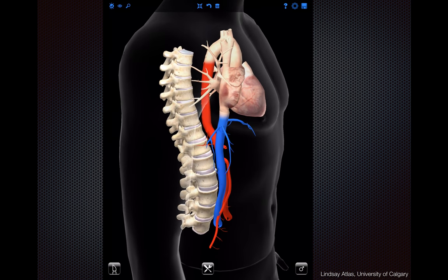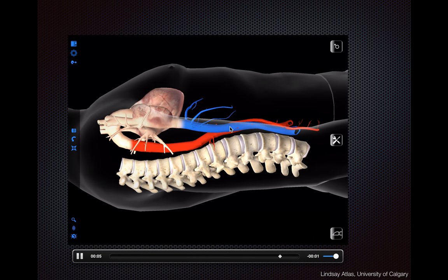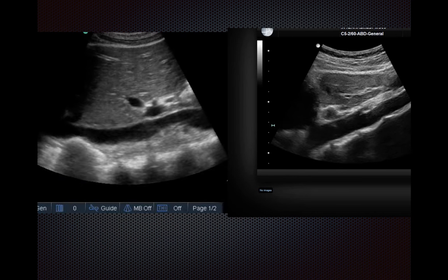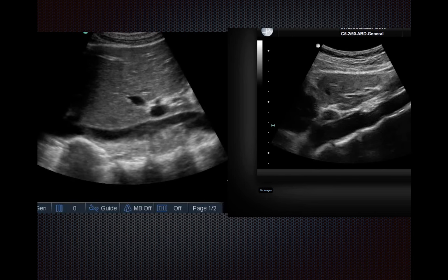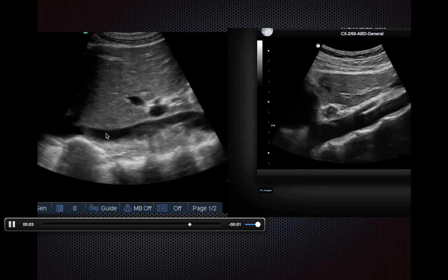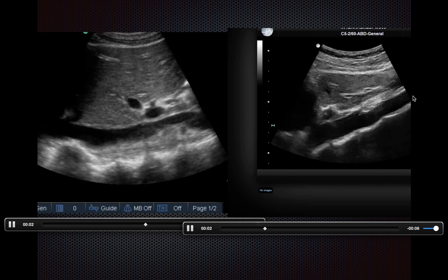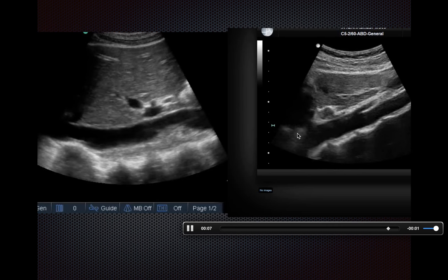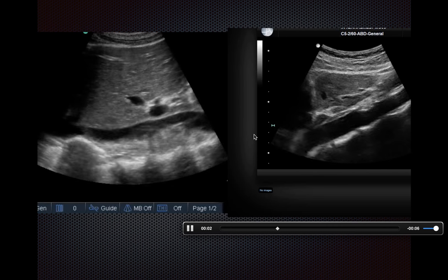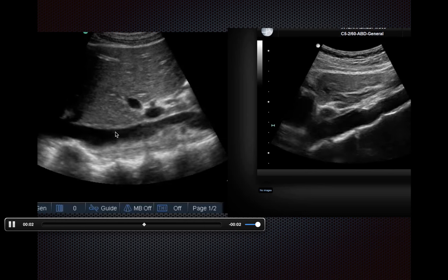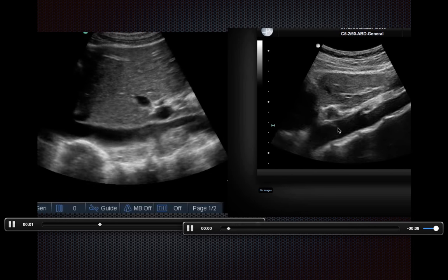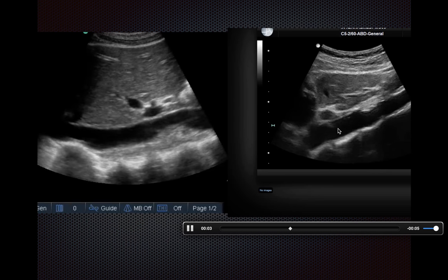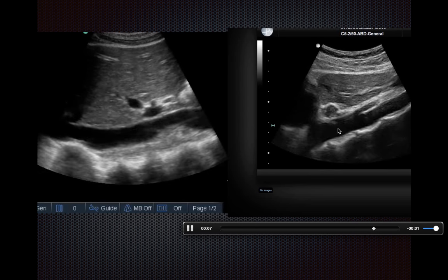The IVC goes up into the right atrium, whereas the aorta dives down below the heart. Putting the two clips side by side, you can see the IVC going up into the right atrium, and on the other panel the vessel dives down below the heart — that gives you a clue that you're looking at the aorta. You can also see that the IVC has a double or triple waveform, whereas the aorta is quite pulsatile and not as obviously triphasic.